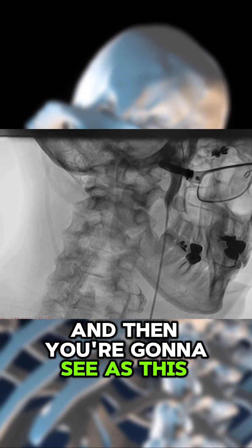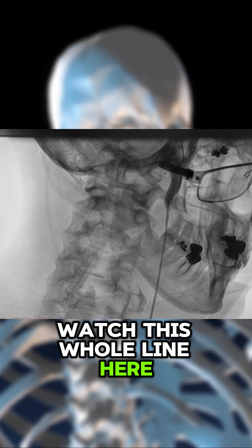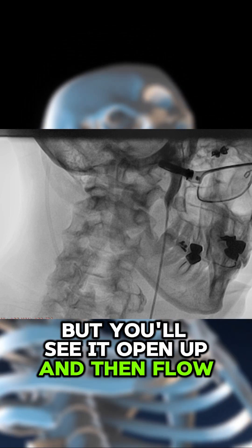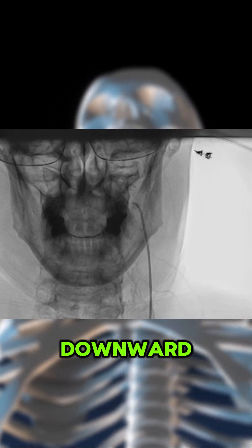As this guy turns his head, watch this whole line here — you're going to see it open up and then flow downward. Boom, it just opened up and all flowed downward.